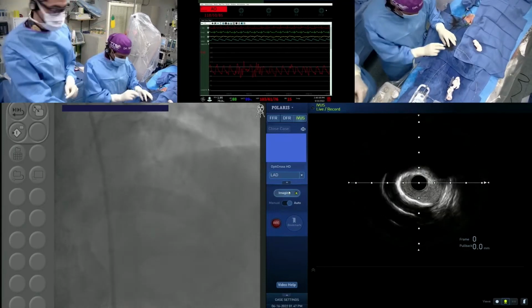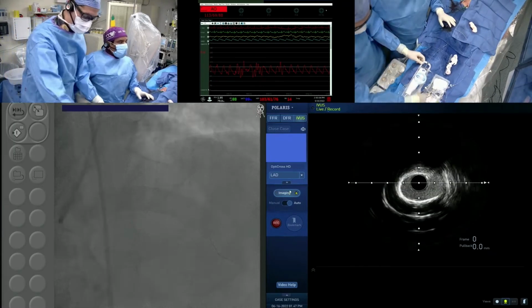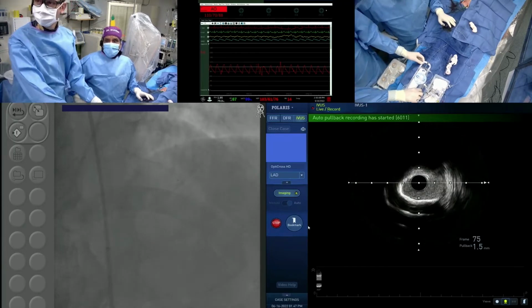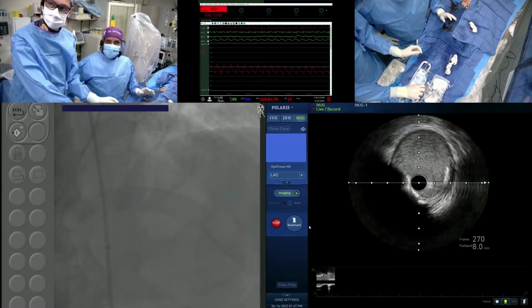So that's okay. How are we doing for the... Okay, can we see even the start of the pullback, like 270 calcium? So I'll start the pullback from here. Is a mid. Can you see that aneurysm or no? Not all of the aneurysm part. The 270 calcium, here is a big chunk. This is that aneurysm. See that? This is the aneurysm, big vessel.